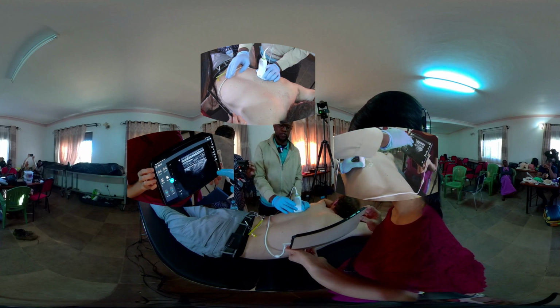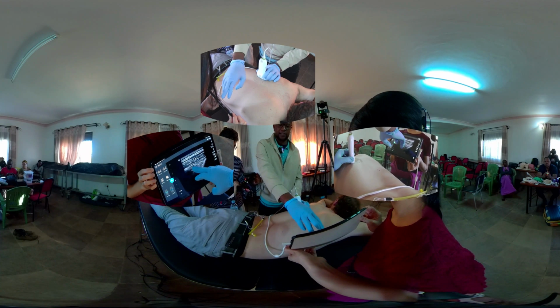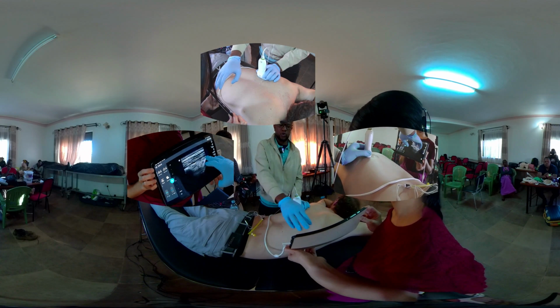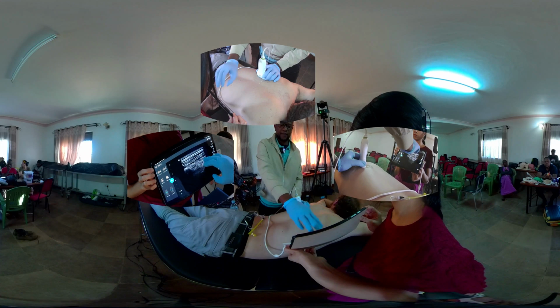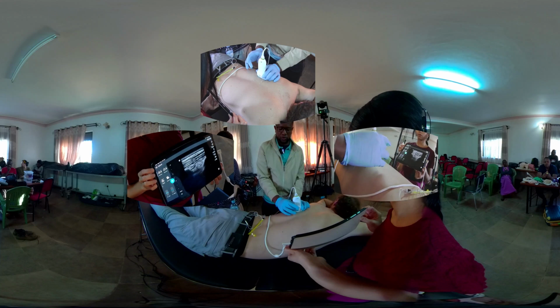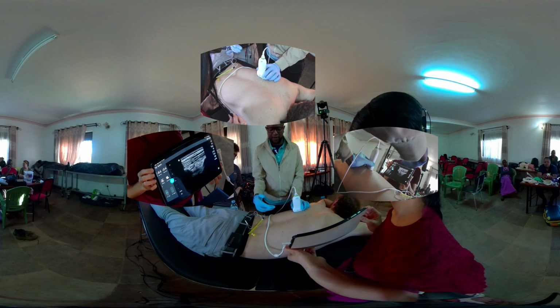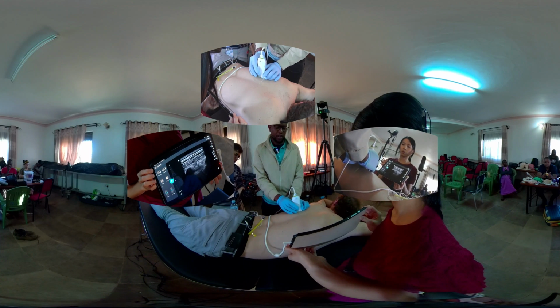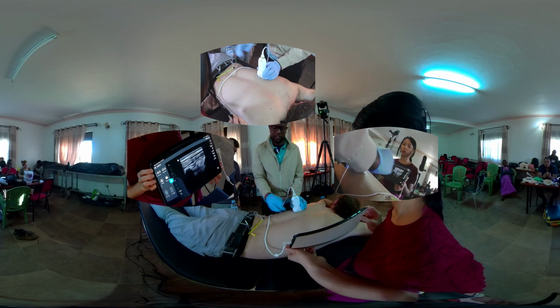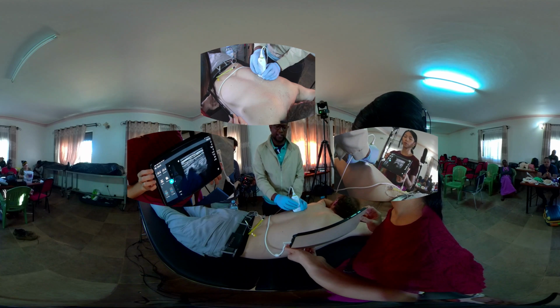You want to deposit your local anesthetic just below the erector spinae muscle, which is a muscle right at the top of the transverse processes. And your local anesthetic should spread, you see it as an expansion of the fluid in that plane. So you've got two options with your needle approach. You can either approach it from the caudal aspects towards more cephalad, or cephalad towards the caudal aspects. I prefer from the caudal towards the cephalad aspects.